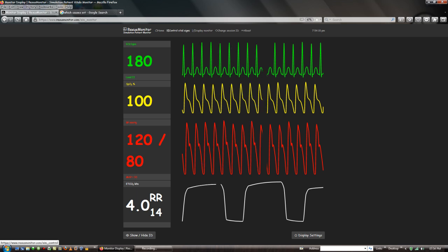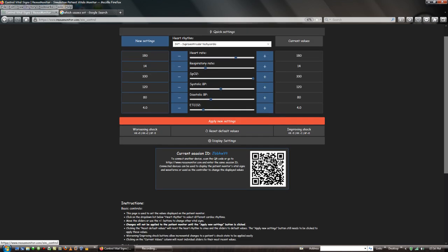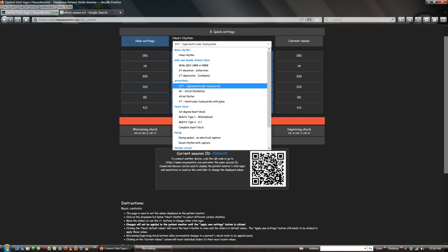We are moving on. This can also happen after birth if the mother has had a complicated birth. This rhythm can also happen if that happens. We're moving on to the next rhythm.